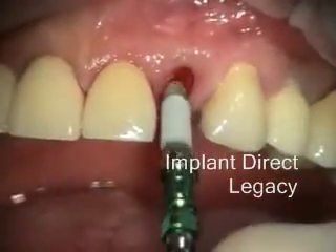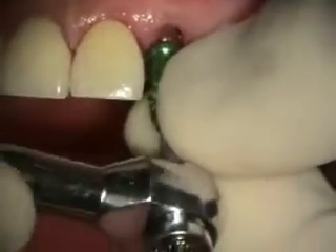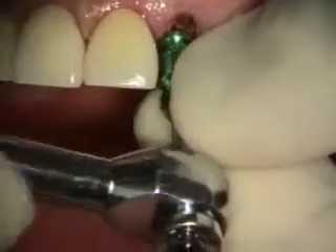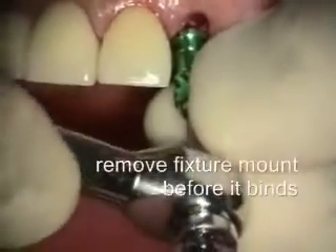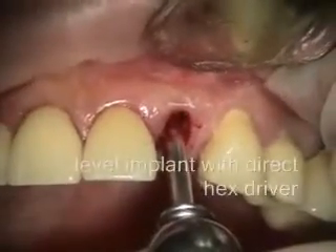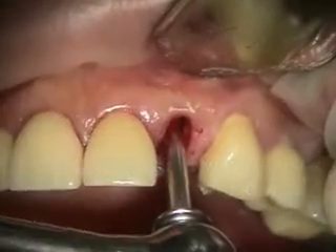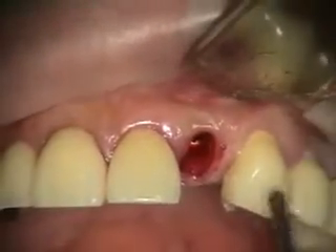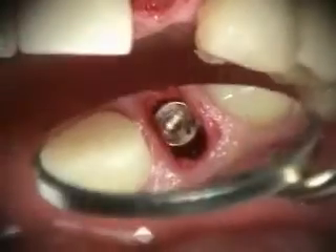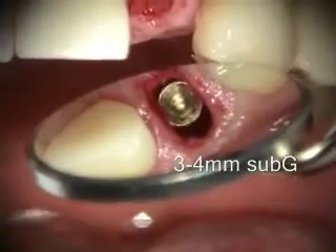I'm putting in a 3.5-13. We've got our implant leveled and got the hex facing the facial.